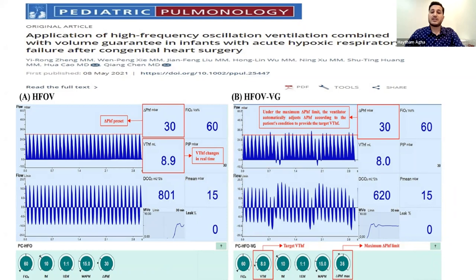If you find that the wiggling disappeared on one side, you should think of either a tube deviated to one side or secretion obstructing this side. If you find that the wiggling is decreasing on both sides, you should think of decreasing compliance and a poor response, or maybe actual secretion obstructing the main trachea or ETT.